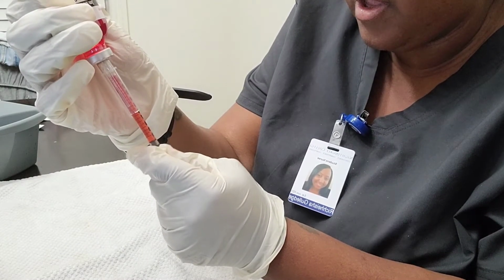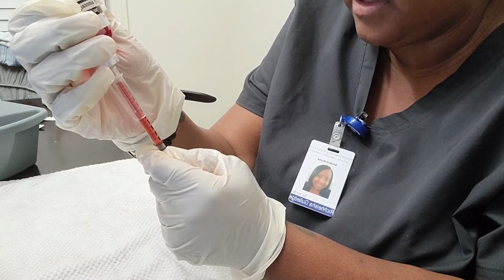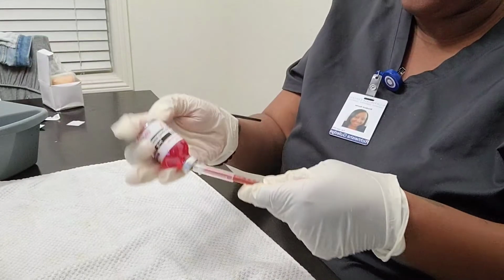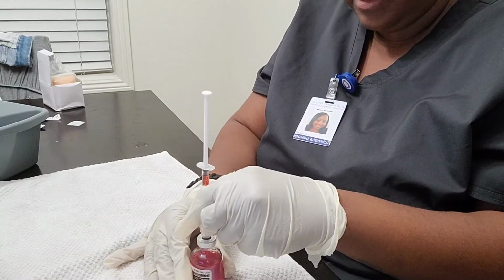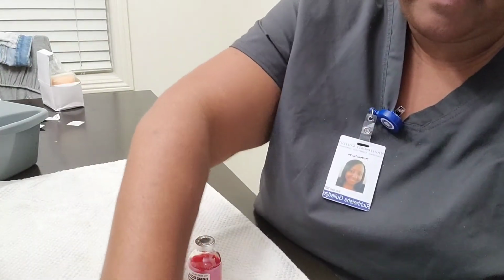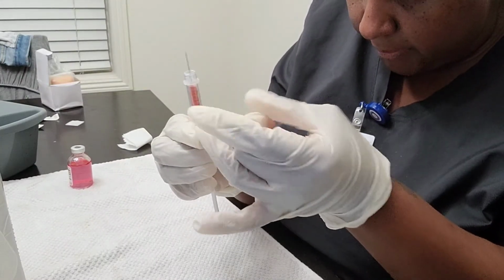I really wish that I had the correct needle for this, the size, but I don't. I don't have one. So at 1.5, I'm going to go ahead and pull that out and then safely set that in a clean area, protected. Okay, so now I will go ahead and get rid of any bubbles.